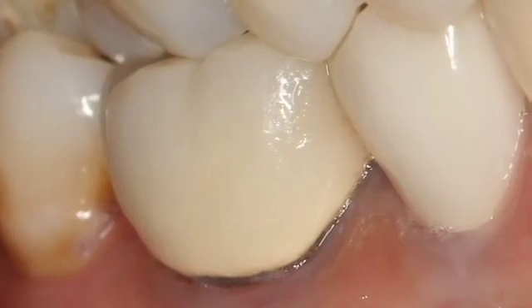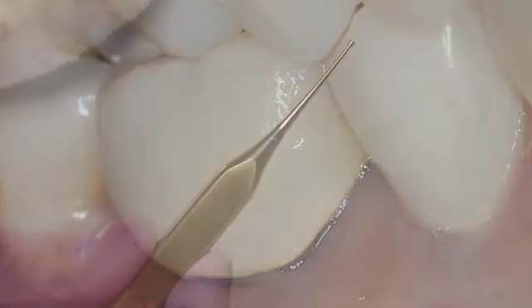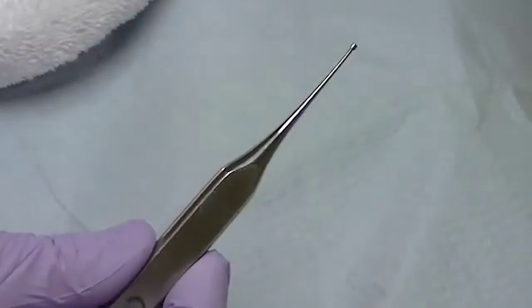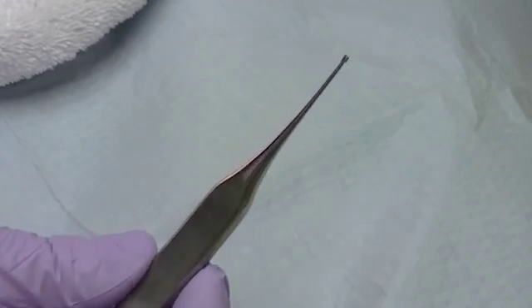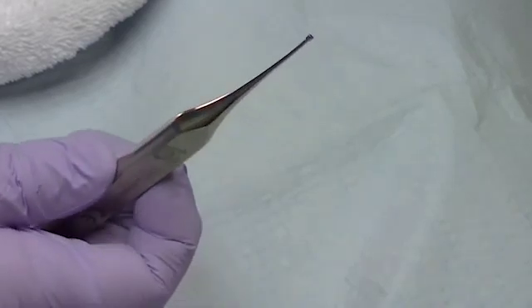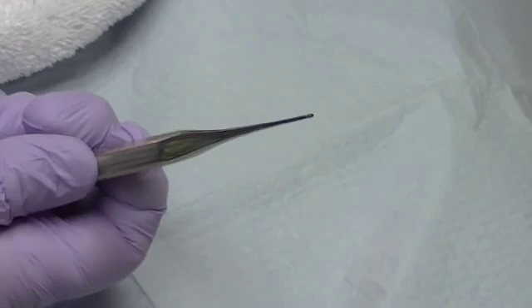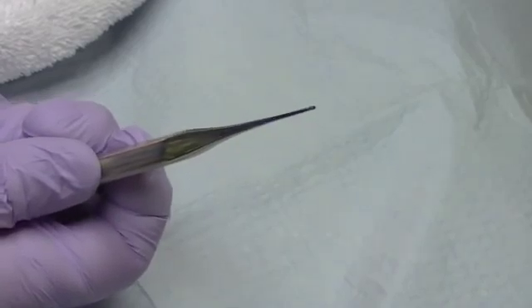Here we want to demonstrate a different technique. To remove the crown, we're going to use a really innovative tool called the Golden Whamkey. The Whamkey is a series of three instruments, and you can see the shape of it. There's a little ball on the end, and we're going to use this ball to remove the crown without sectioning the crown in total. You can see the unique design of the instrument.